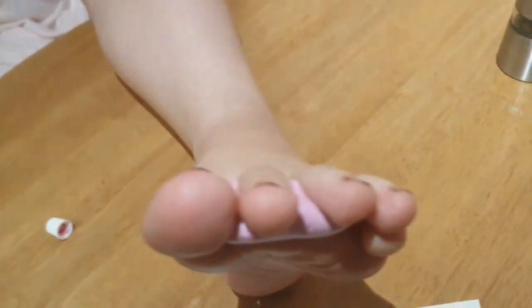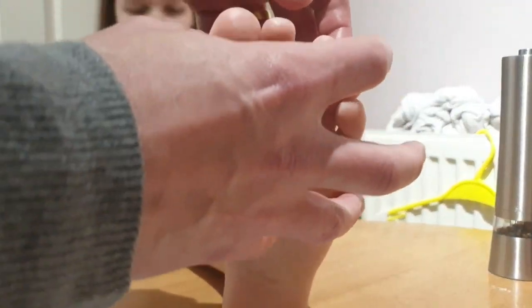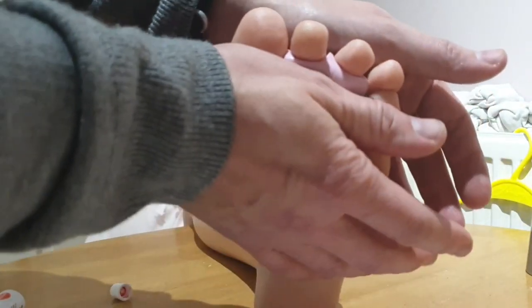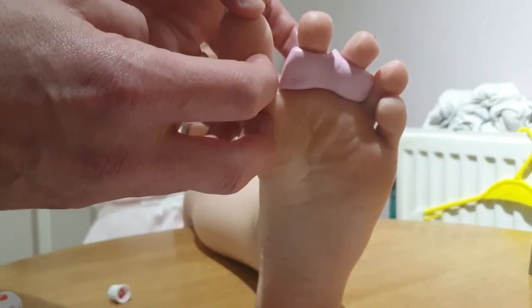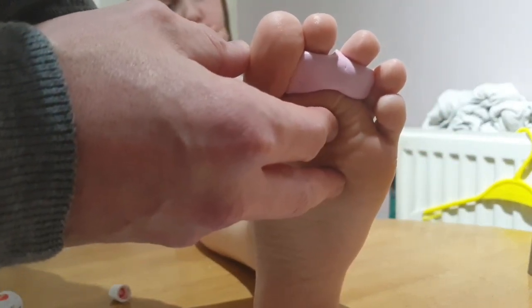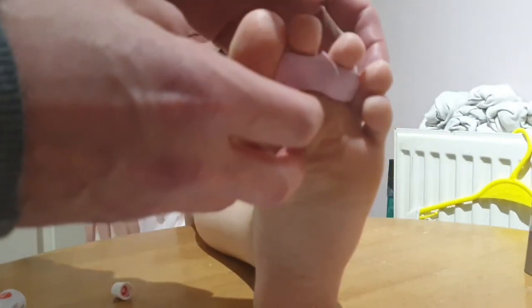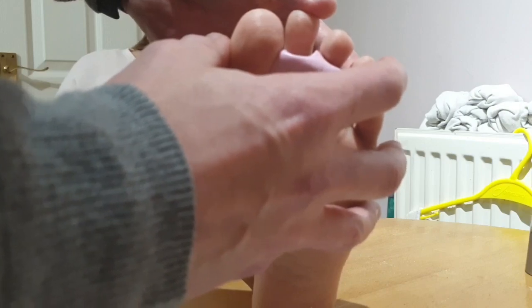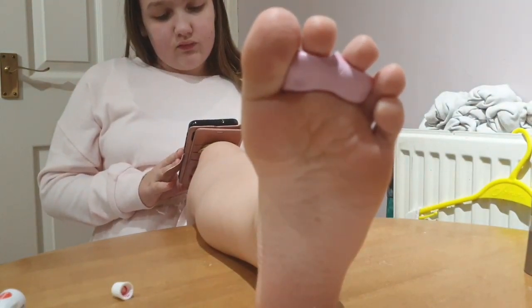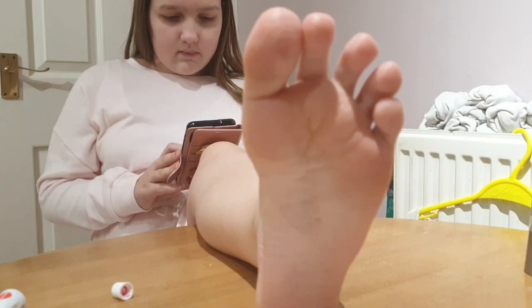From the top it will look like that. The idea with this is that these toes want to close together. If that toe is up in the air, that prop will keep them somewhat separated, and then when the shoe presses on it, the toe has somewhere to drop into. This is essentially using that toe and that toe as a buttress — if the big toe tries to abduct outwards, you've got three toes holding it back. If you've lost the function of the second toe and it's out of the way, it stops the big toe filling the gap.